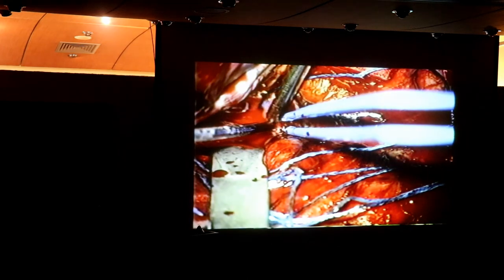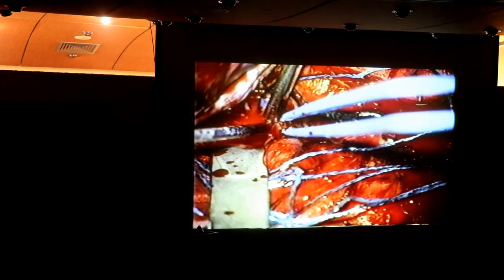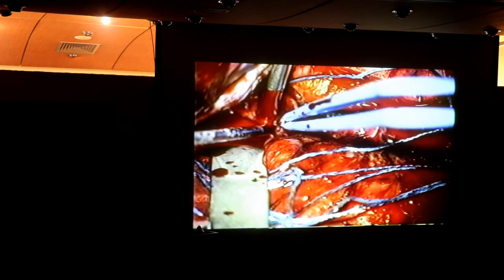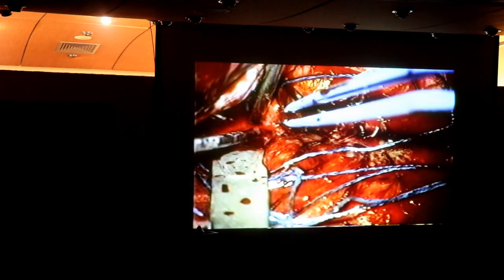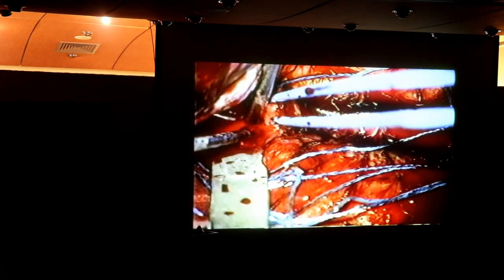Now, this is a very bad moment. It ruptures before I'm sure of what the relationships of this aneurysm are. I want to know, what is the fundus? What are the branches, the temporal branches and the frontal branches of the middle cerebral? Where are they before I put my clip? And I tell you, there's nothing that you can do about it.